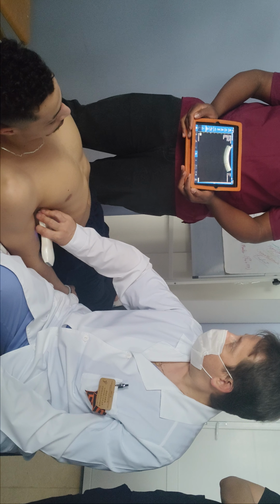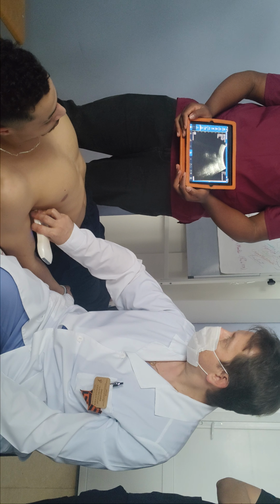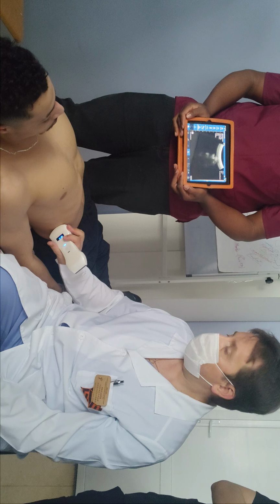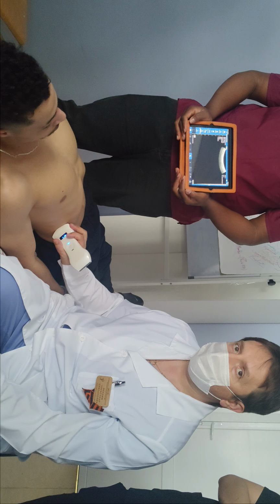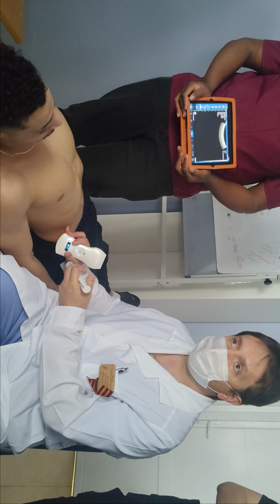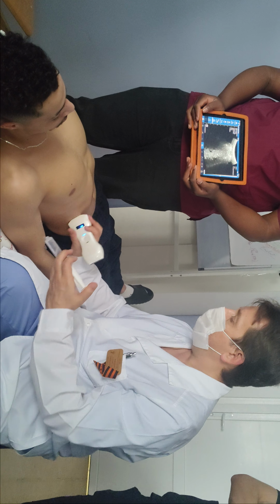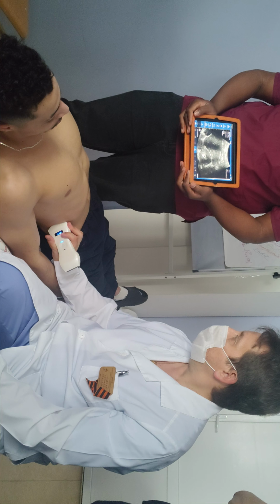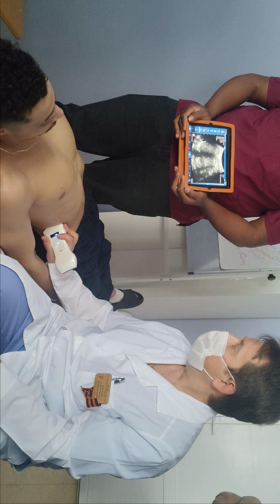So, in the lower part of the lung, we cannot see anything, of course, nothing bad, I mean, only lung structure, and we have no vertical B lines. It means that he is quite healthy, a normal picture of the lung. Then we are transferring below the ribs. What for? Again, we try to find together kidneys, hepatic zone, and maybe lung picture. Here it is a rounded shape, you see? This rounded one is a kidney.